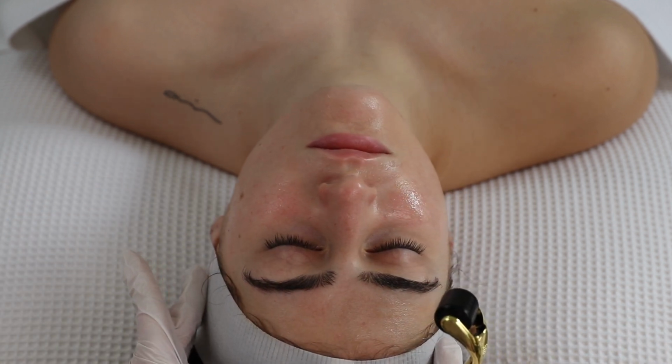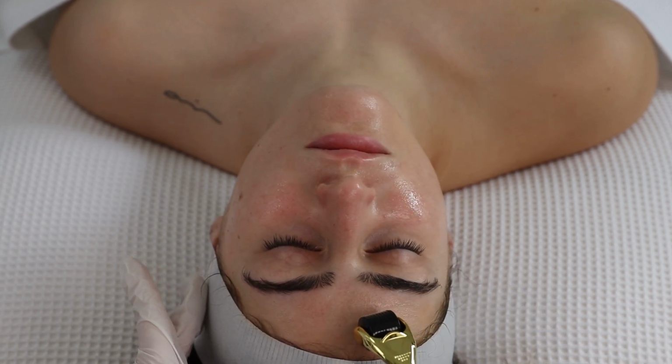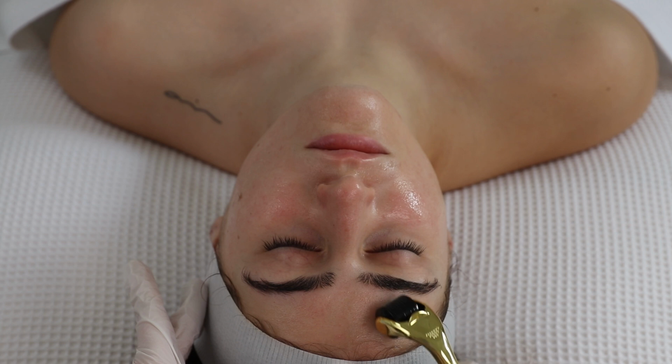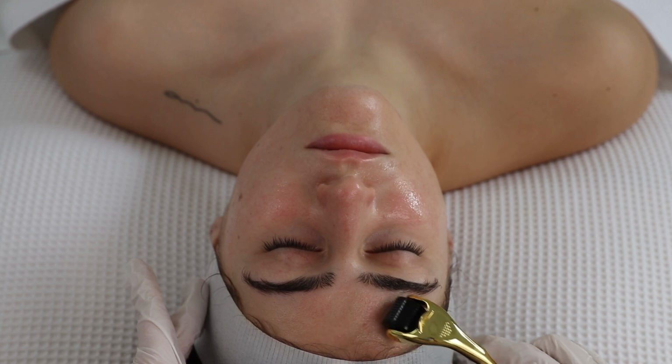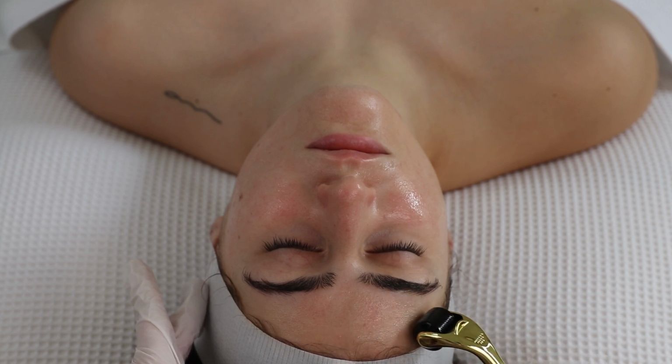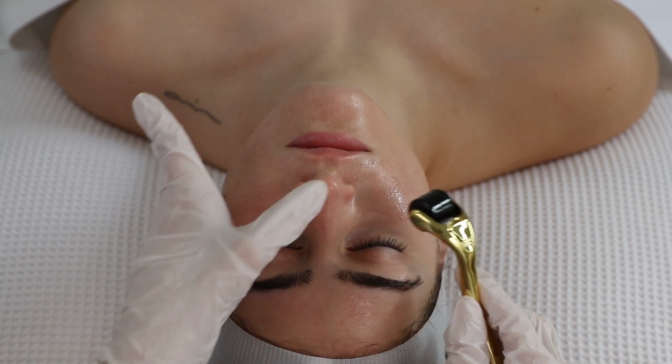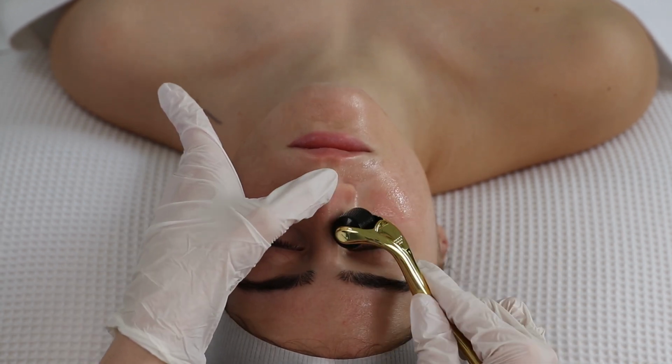Move on to the forehead, and for this area make sure that you are not applying a lot of pressure as the skin is very thin, and during your treatment with the dermal roller, if you see any blood specks, ease off with the pressure, as you should not be seeing any blood at any stage during treatment. Once that is done, move on to the nose, upper lip, and then finally chin.